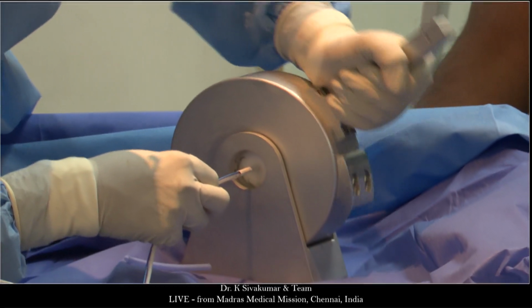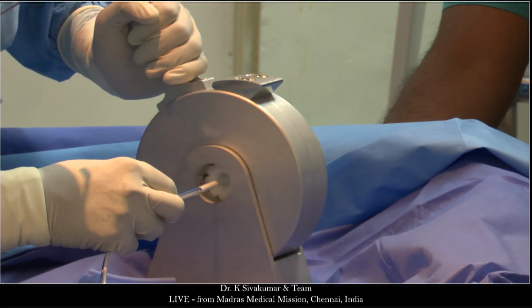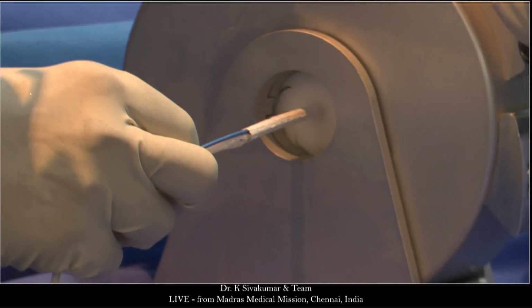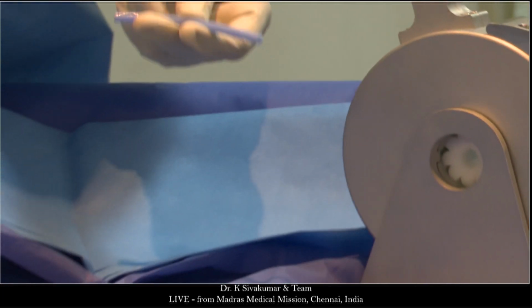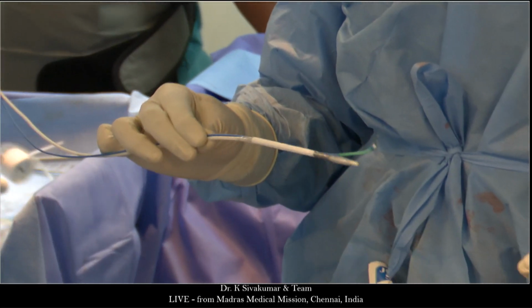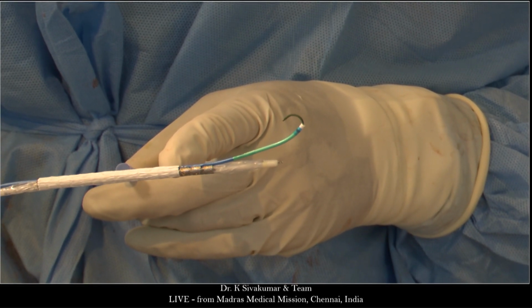You have the catheter passing from the strut, yes, correct? Yes, from the junction between the covered and uncovered. So I will take it out and show you in a much more magnified way. Just give me a second. Very interesting, actually. I will come closer to the camera so that you can see it far better. Now I will show you. This is the covered portion, the uncovered portion, the junction where I have come out. Can you see that?